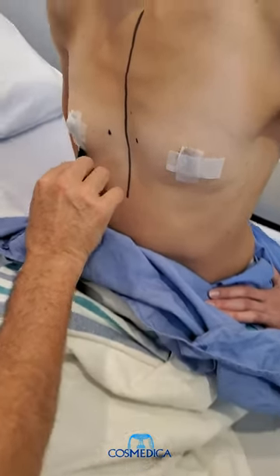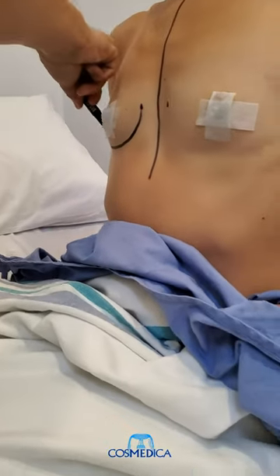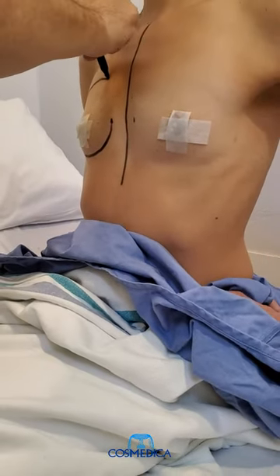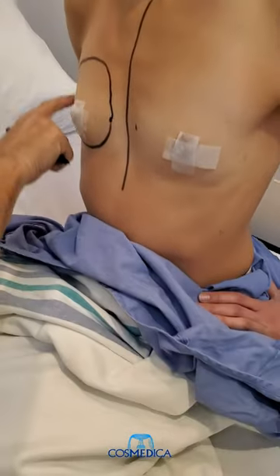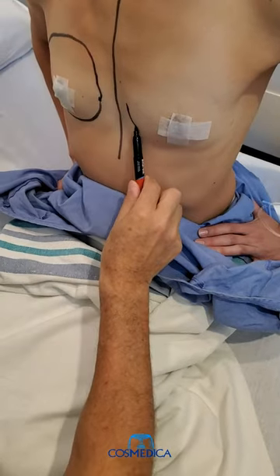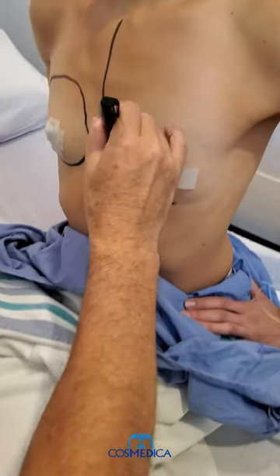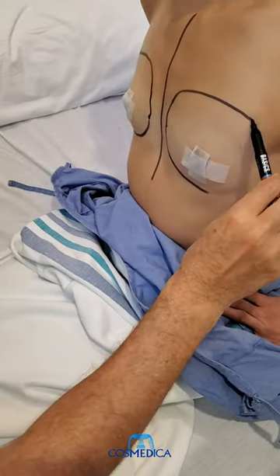Then we mark the current fold and the current borders of the breast, which we're going to expand. When we put the implant in, we're going to go a little bit beyond that. This is just to give me some landmarks when I do the intraoperative markings, and we will of course accommodate the size of the new implant.